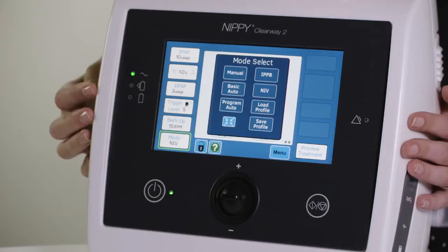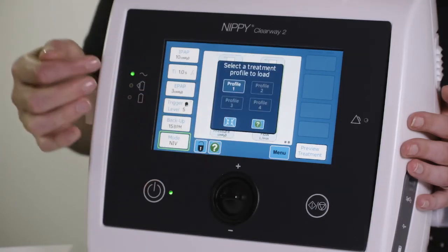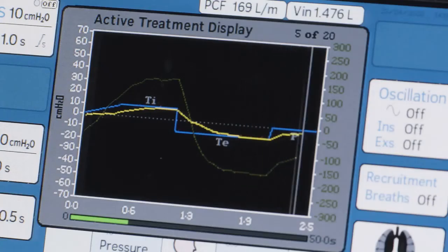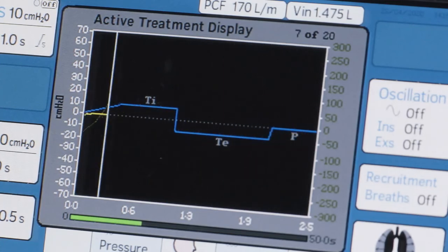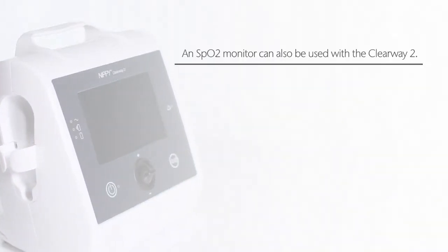Each mode or different prescription settings of the same mode can be stored in one of four profiles on the Clearway 2, allowing multiple prescription settings to be easily accessible to users. The Clearway 2 displays insufflation volume and cough peak flow information on screen when using an MIE mode. An SPO2 monitor can also be used with the Clearway 2.